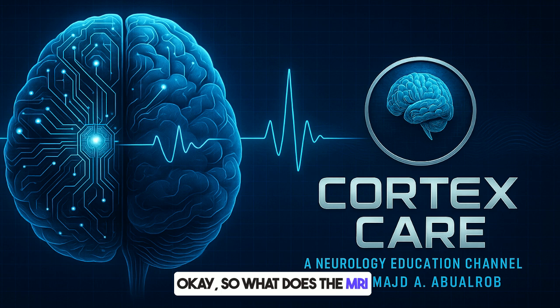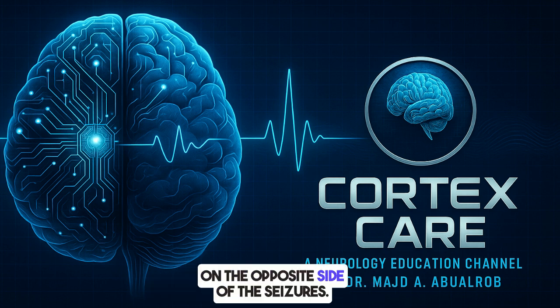So what does the MRI look like in LGI1? Similar to NMDAR, can it be normal? Yeah, during that FBDS stage, the MRI is often normal. Okay. Though maybe up to a third might show some subtle T1 or T2 signal changes in the basal ganglia on the opposite side of the seizures.